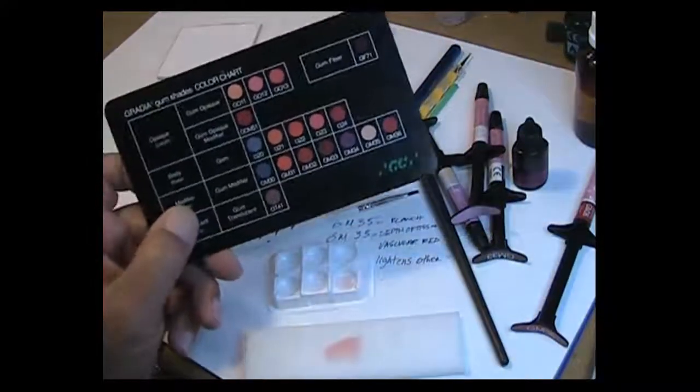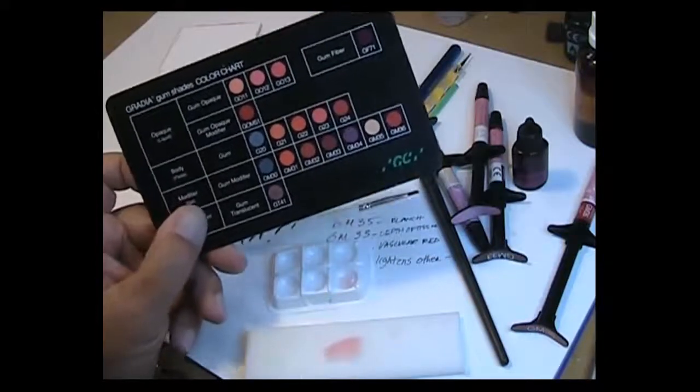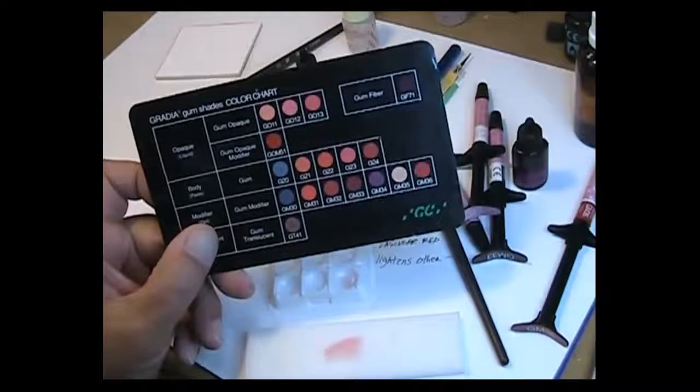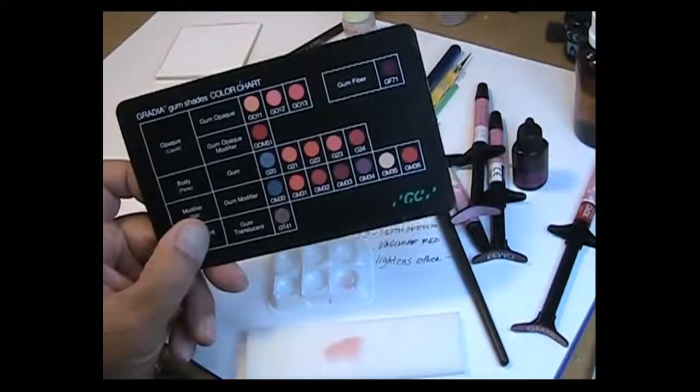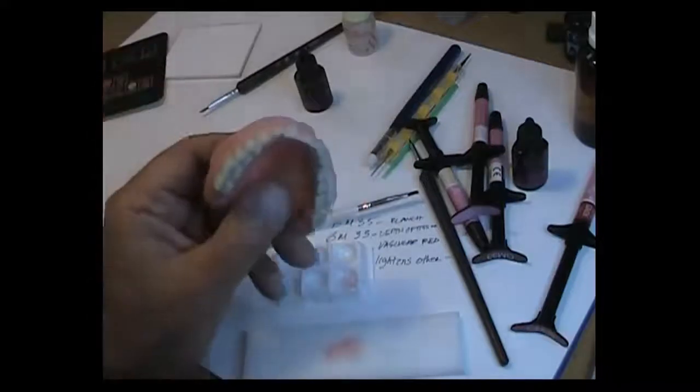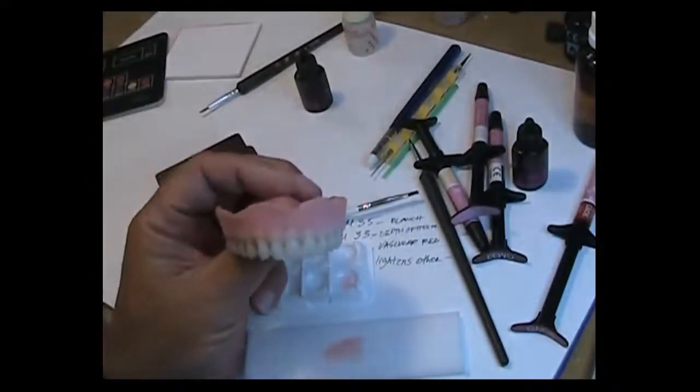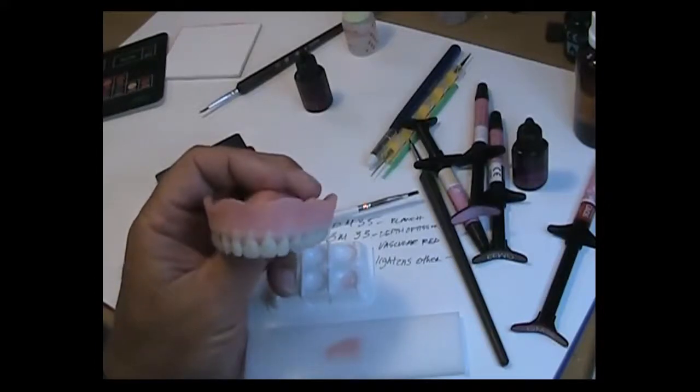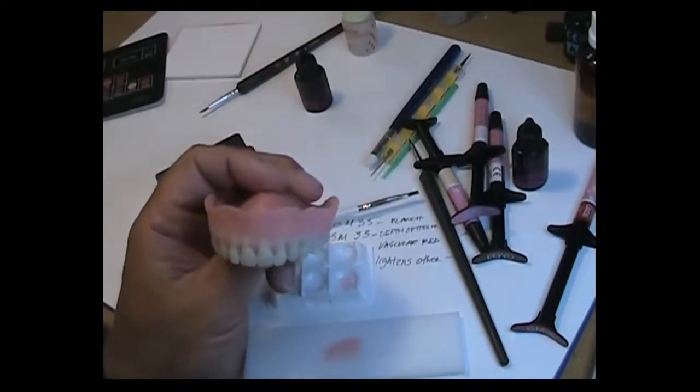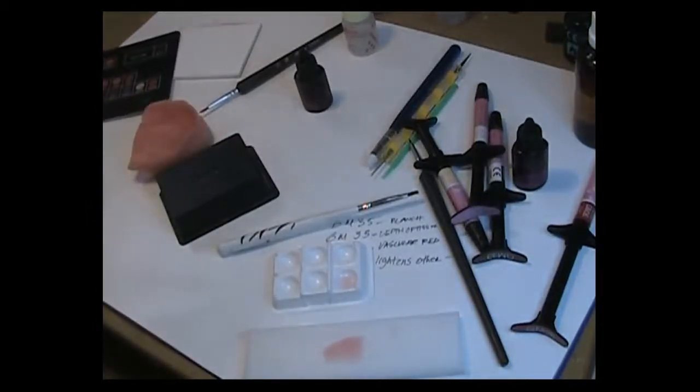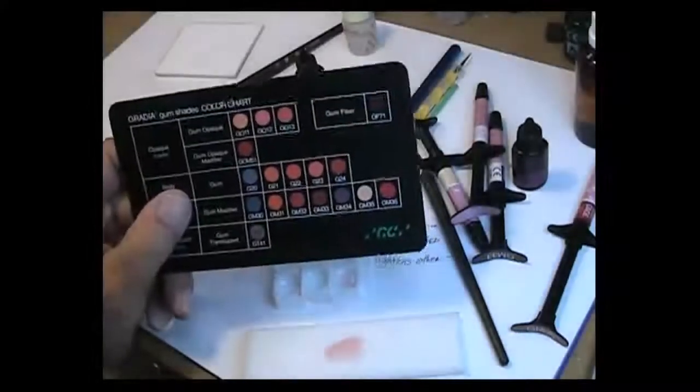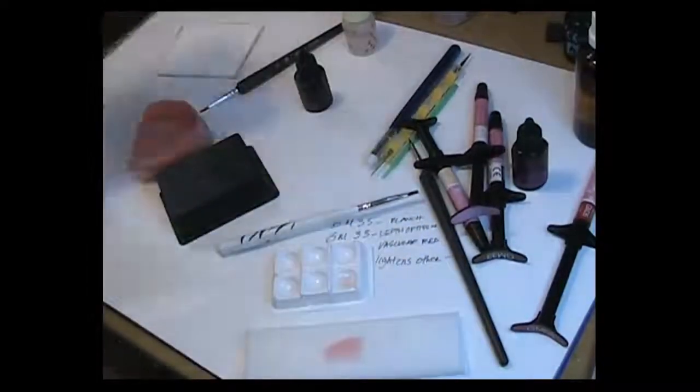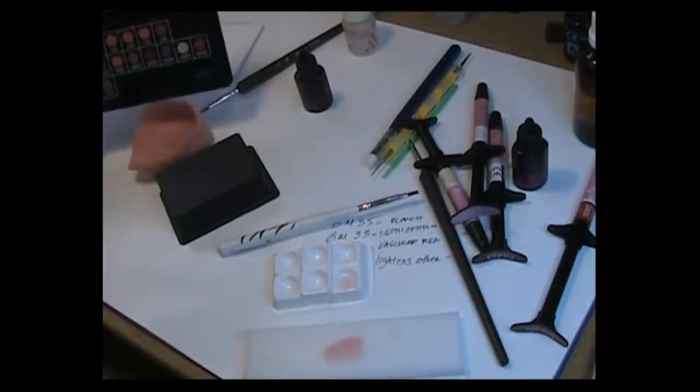But depending on your canvas, and your canvas of course is the base material that you're using, will really then define which products you'll be using to get the effects you're looking for. Anyway that'll get you going. This is the Gradia gum colorant system for dentures, for acrylics. These are the products that I'm recommending and a few of the tips and I hope this helps you out.